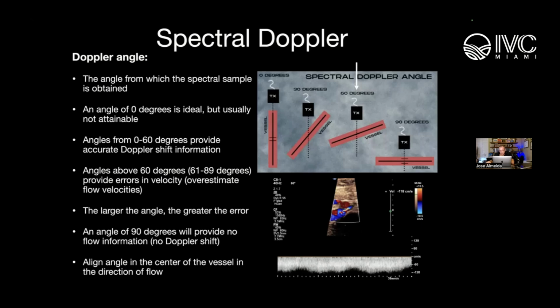And then the other thing on the pulse wave Doppler, you see the velocity, a negative Doppler shift below baseline, up to 120. The scale is set at 120. If you had this scale set at 60, for example, this would be what we were talking about: the signal would actually wrap around above the baseline and alias because it was set improperly.